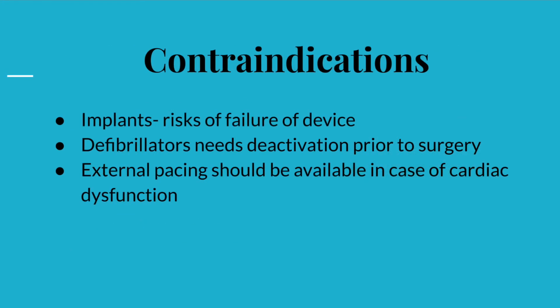Lastly, when is the time that we should not use a diathermy during the surgery? One example would be where there is the presence of an implant such as an ICD device, which can fail when it is not deactivated prior to the surgery. And this is the reason why external pacing should be made available in case of cardiac dysfunction.